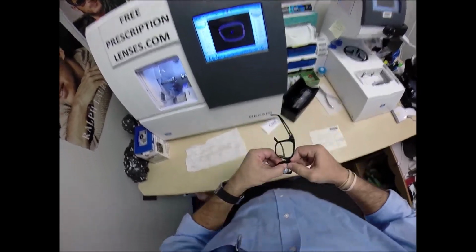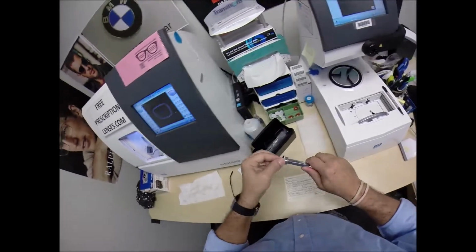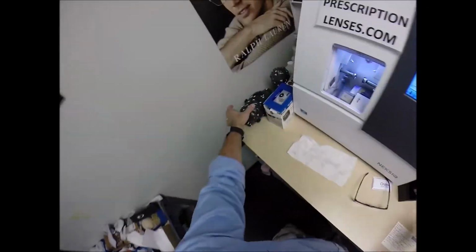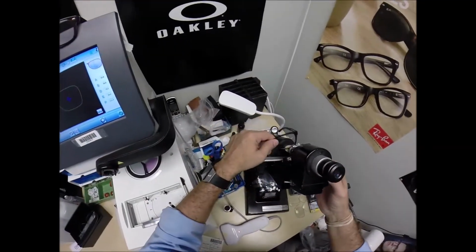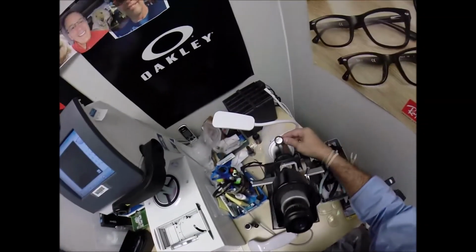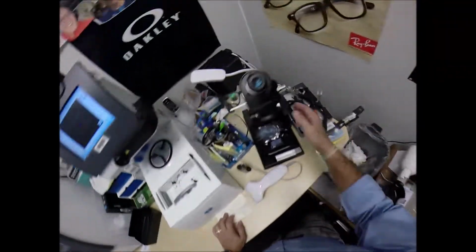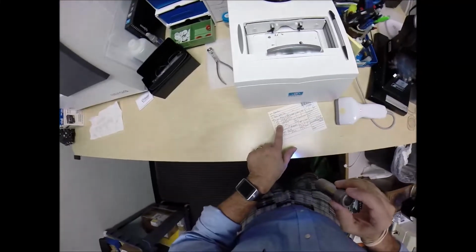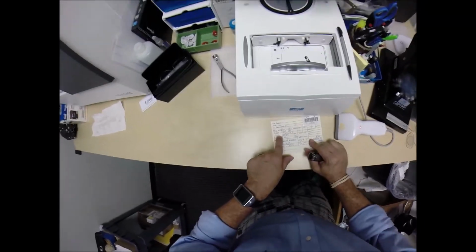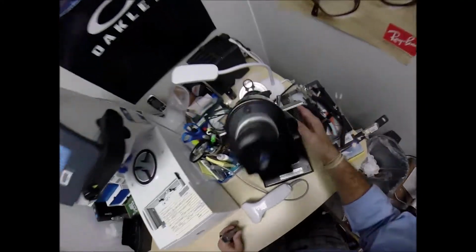Again, tucking it into the outside corner. Now I press down, it snaps in there easily. Take the block off, dry that off again, throw that in there, add to my sticker collection. Come down here, put it in over that black dot. Turn the axis wheel to 179, the corresponding axis for the astigmatism of your left eye. Check the power, and I am getting 0, no power whatsoever, Plano, which is not just a city in Texas, it also means no power.